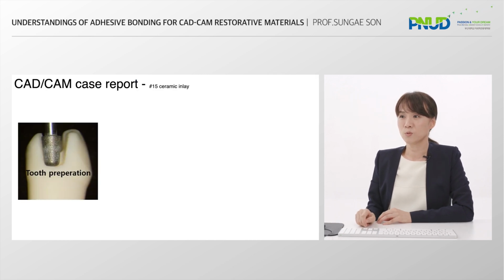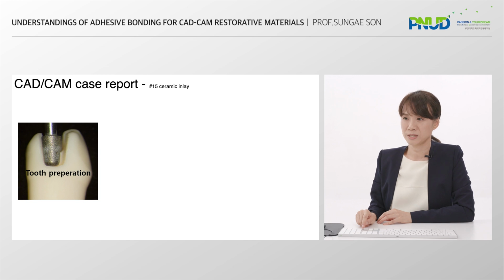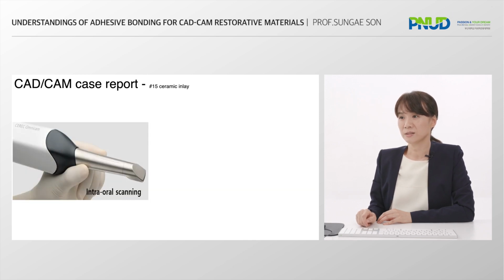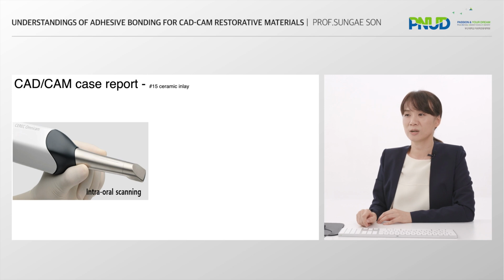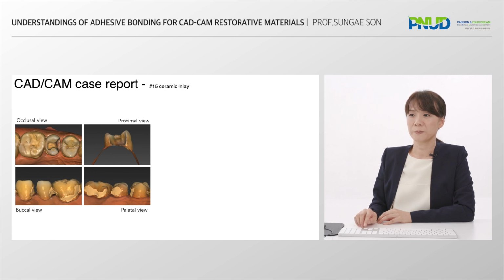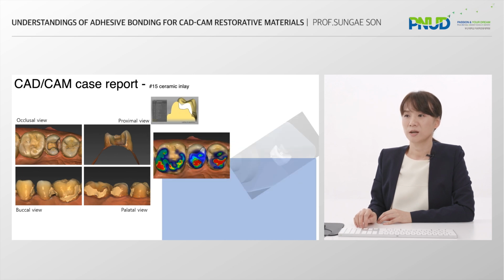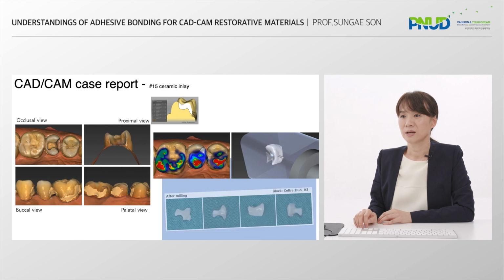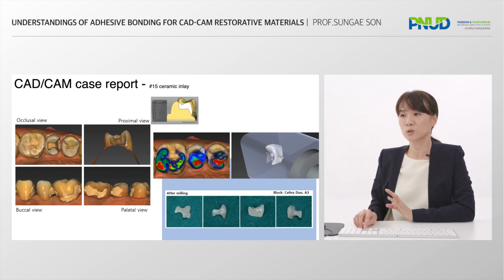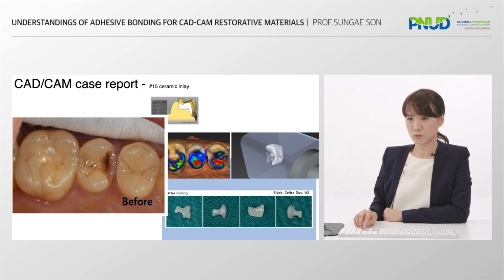This is a case of one-day chairside CAD-CAM restoration. The dentist performed tooth preparation of the second upper right premolar for inlay restoration. Then they acquired the intraoral scan image using an intraoral scanner. Then they designed the cavity form using CAD software. And after finishing the CAD procedure, they push the button for the milling process. The entire process takes only 2 hours from tooth preparation to final cementation of the inlay restoration.